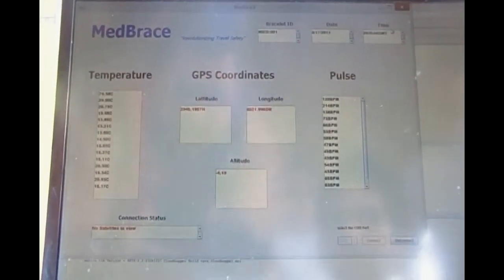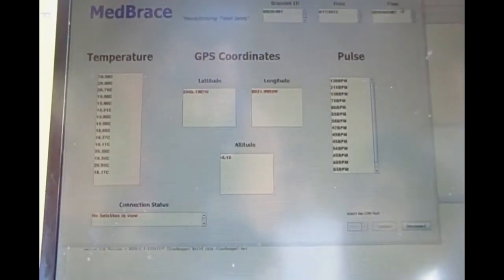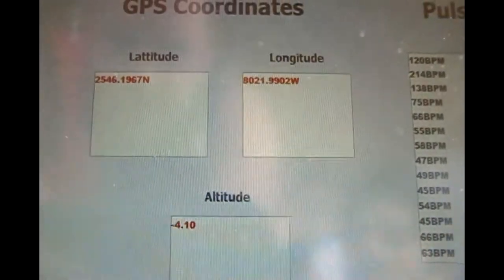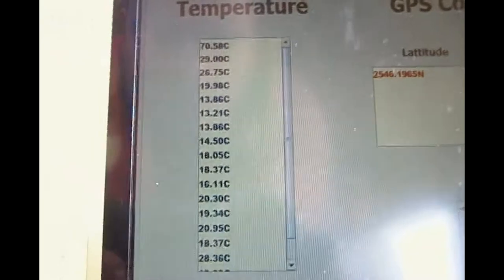Here we have the GUI that we designed for the MEDRACE system. As you can see, it displays all the information from each of the sensors: latitude, longitude, and altitude, the temperature, and the pulse, along with the time, the date, and the bracelet ID.